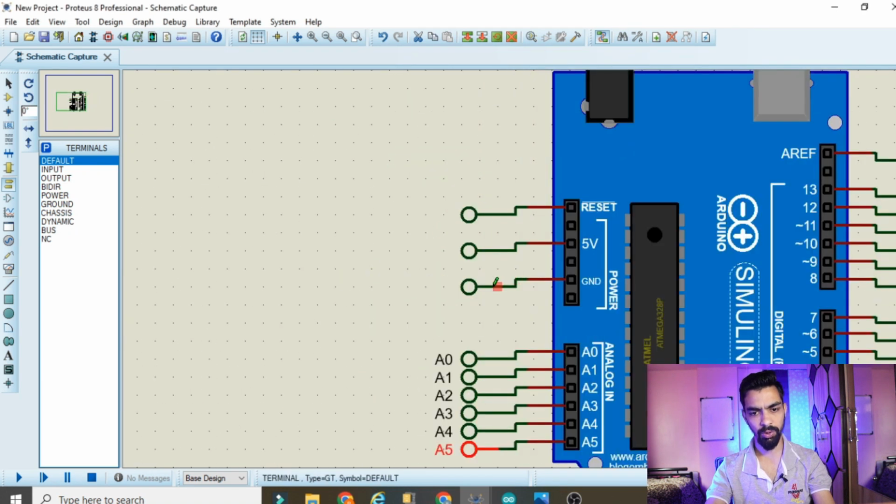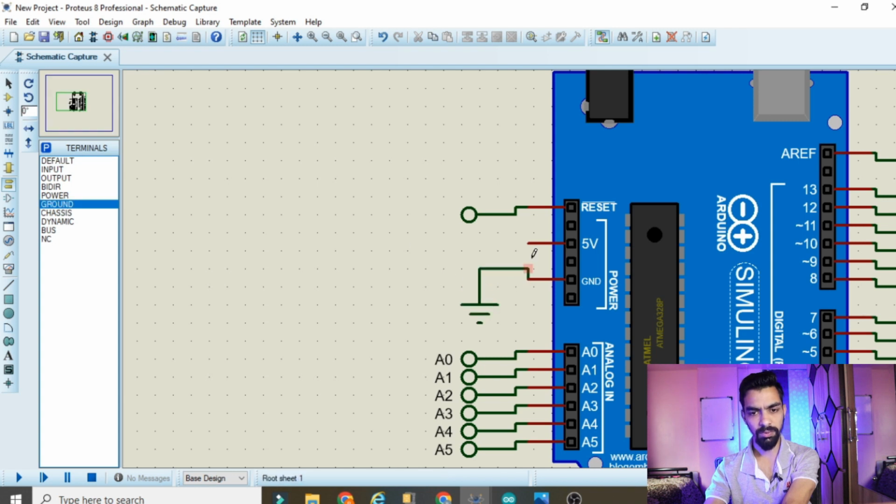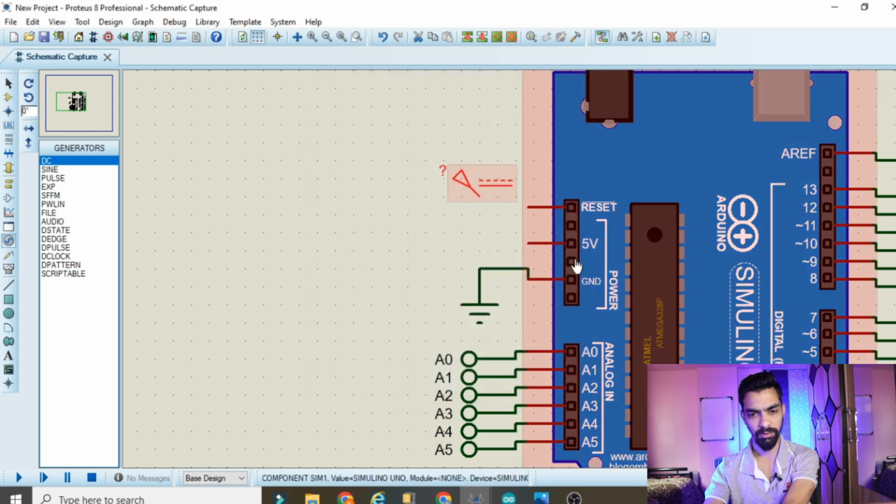Ground pin should be connected to ground. So delete this and delete this VCC also. Select ground from the terminal mode. You can see terminal mode, then ground, and the ground pin should be connected to ground. Then 5 volt should be connected to 5 volt. So go to generator mode, click on DC, take one DC supply here and connect that DC supply to the 5 volt.